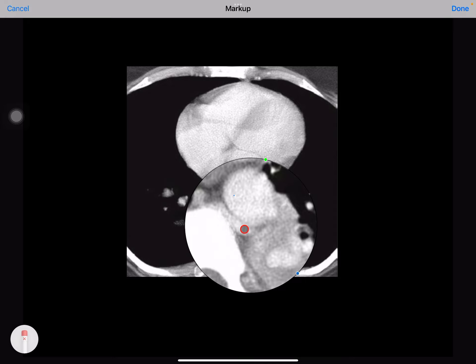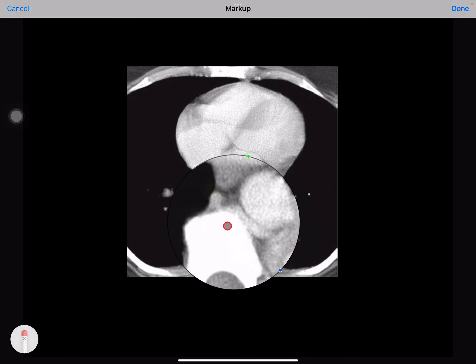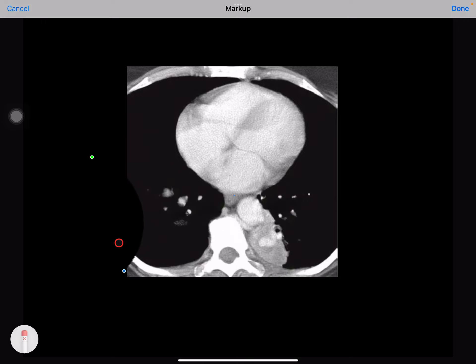This vein is drained into the azygous vein — you can appreciate this is the azygous vein. So this is a case of intralobar sequestration.